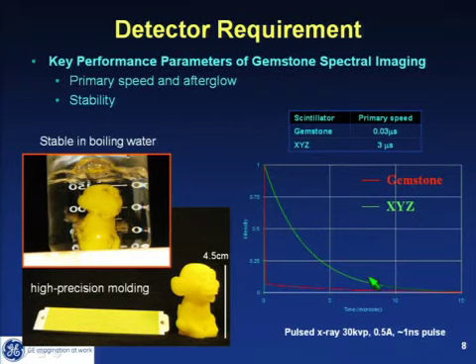You can see that there's a slow decay. Because of the slow decay, although you can switch the generator and the tube side very quickly, there's still signal contamination from the high signal to the low signal and vice versa. So you really want to create a scintillator that can switch very fast.